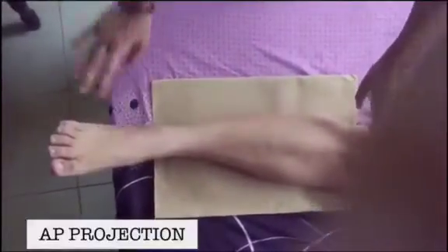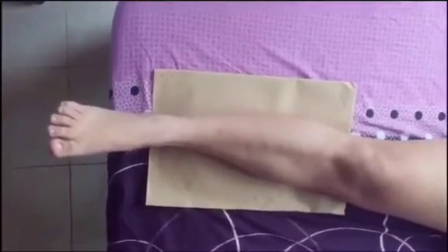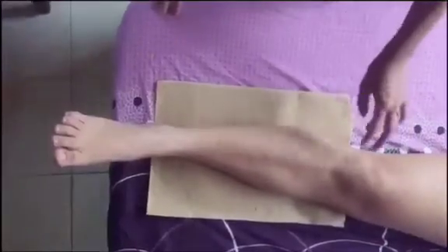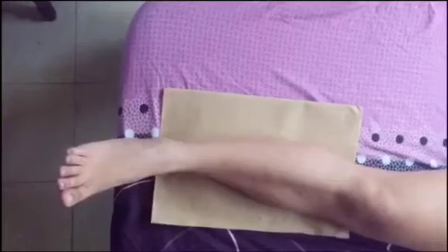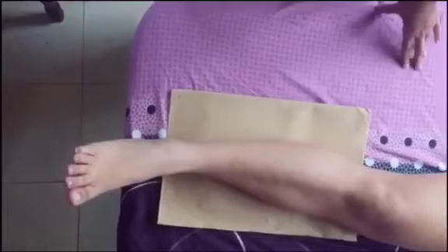The patient is placed in a supine position with an 18 by 43 cm image receptor. Now we're going to adjust the patient's body so that the pelvis is not rotated. Adjust the leg so that the femoral condyles are parallel to the IR and the foot is vertical.